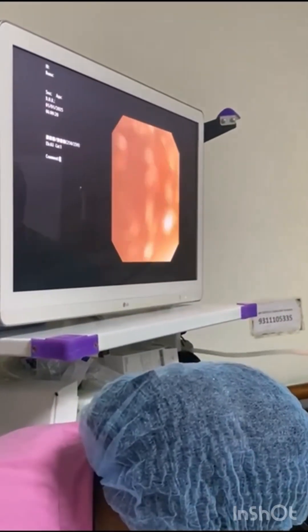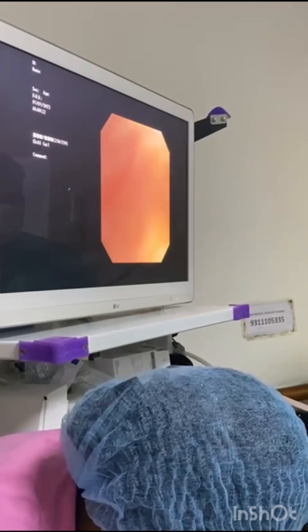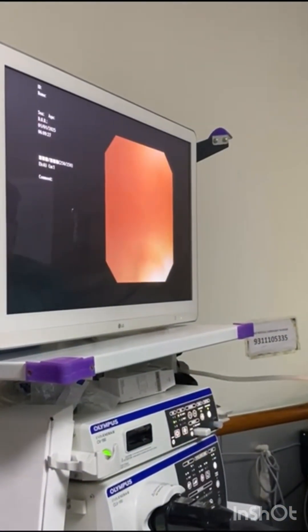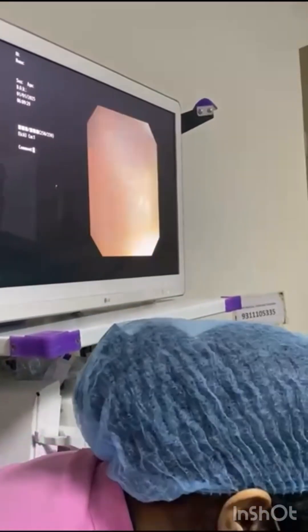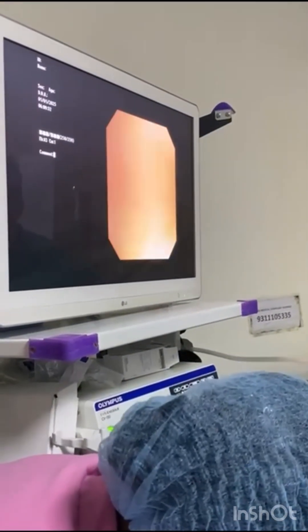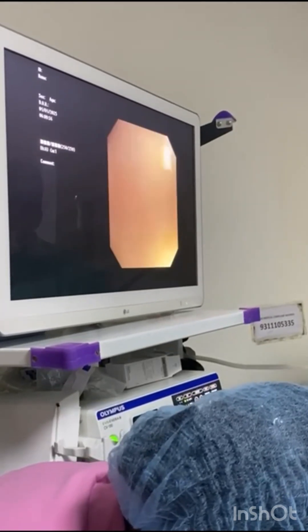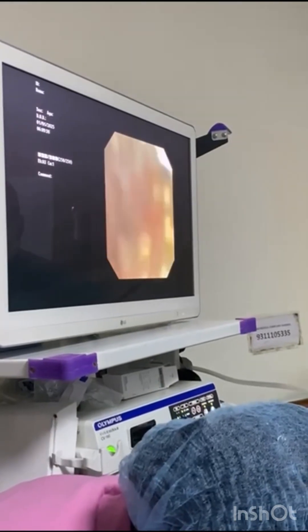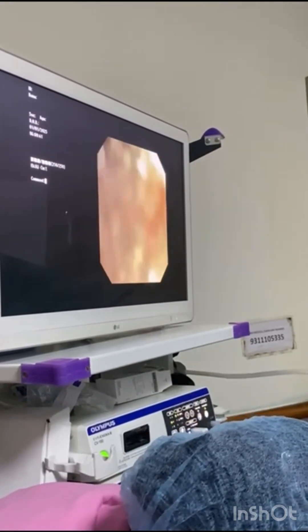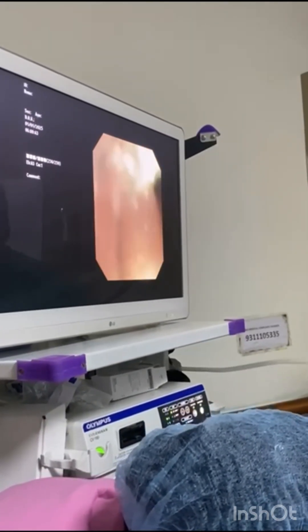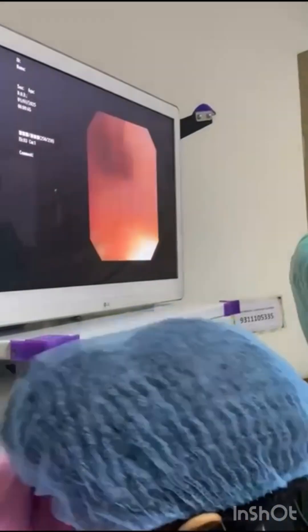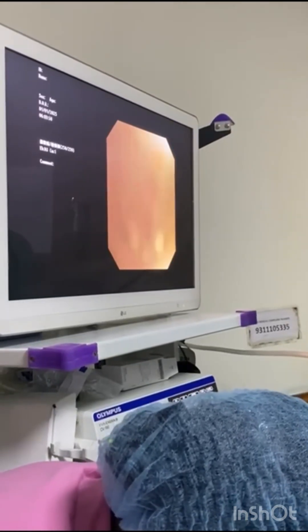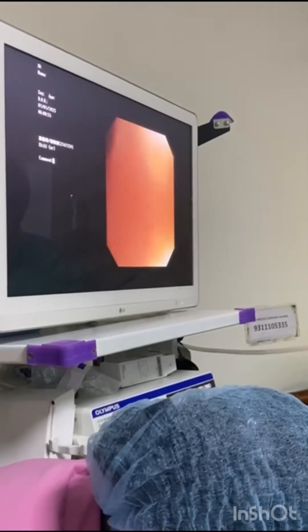I will now see what else is in the larynx. I am moving the tip of the scope further. Basically, this is fiber optic laryngoscopy because I want to see the larynx only. The laryngeal structure will be visible on the screen.